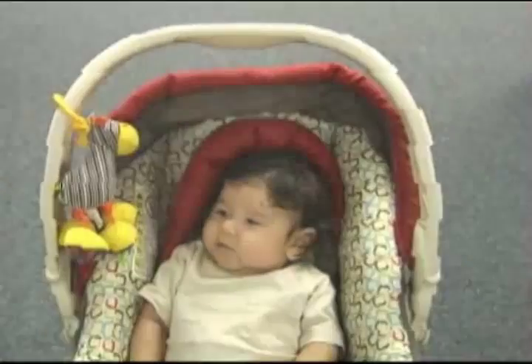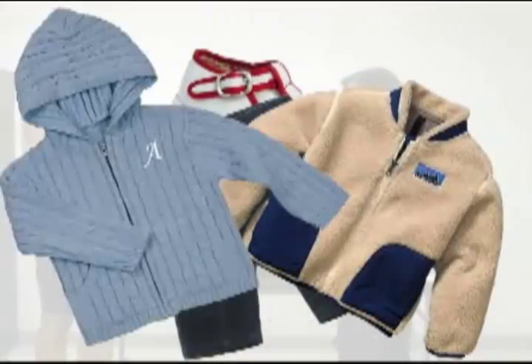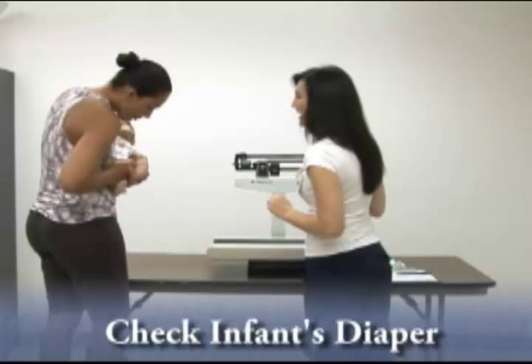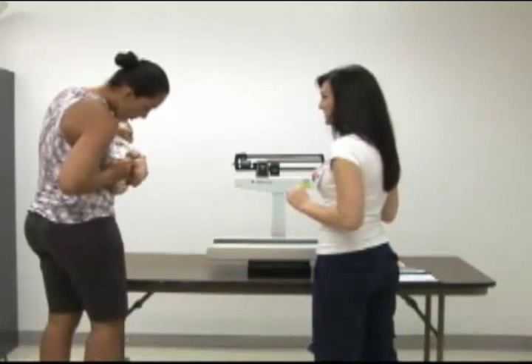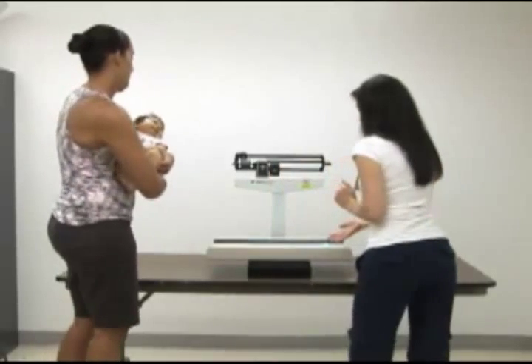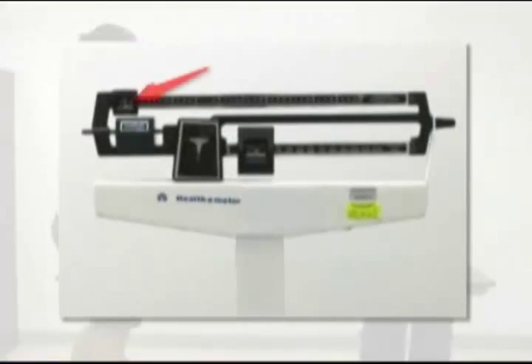Before weighing, have the caregiver take off the infant's clothes such as shoes, pants, jackets, sweaters, or hats that will affect the weight. Also, have the caregiver check the infant's diaper and change it if needed because a full diaper could weigh up to two pounds. Make sure a paper liner is placed onto the scale before weighing and that the upper and lower counterbalance weights are at the far left at zero.